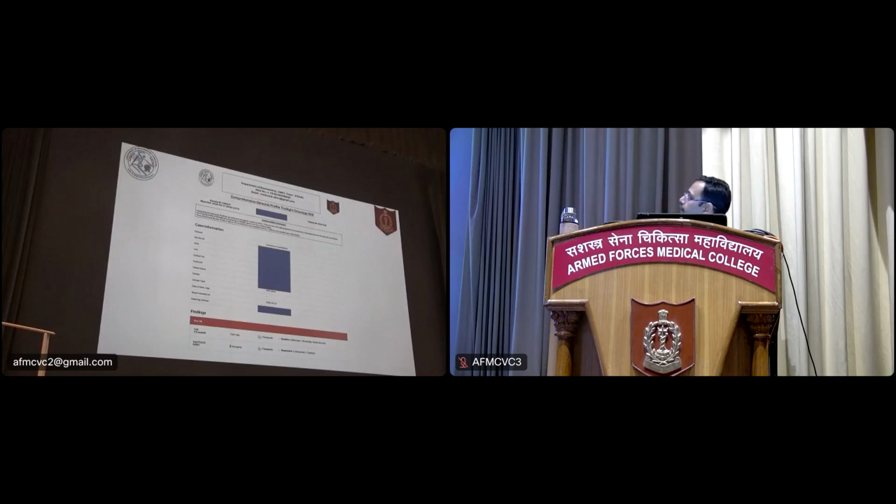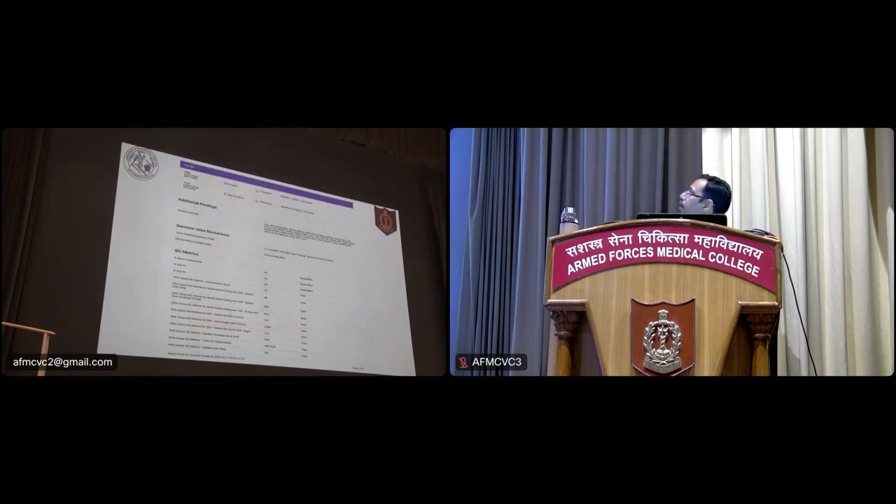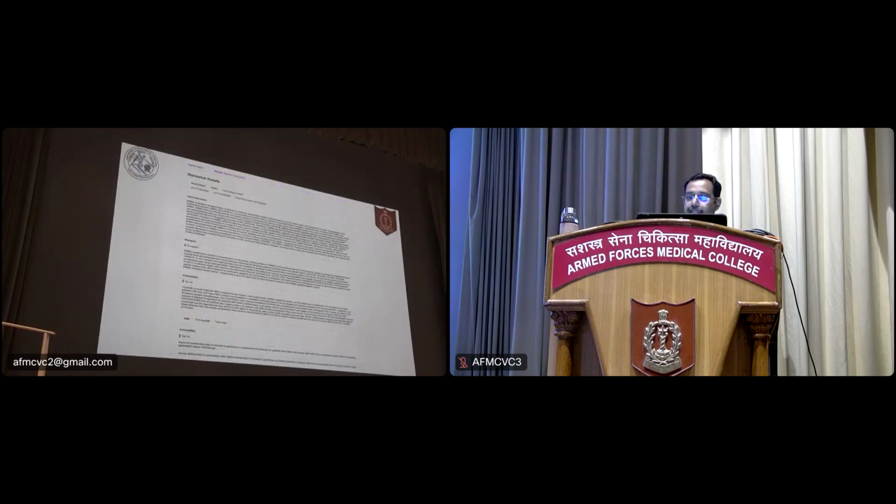So as per the ESMO guidelines, there is an interpretative summary that tells the summary of all the mutations that we have found. Then we classify these variants based on their druggability or targetability into 1A or 1B. Now, in this case, we have got KRAS and TP53 mutations. Then there are certain additional findings such as tumor mutational burden and microsatellite instability. And then there are detailed descriptions of each of these variants.